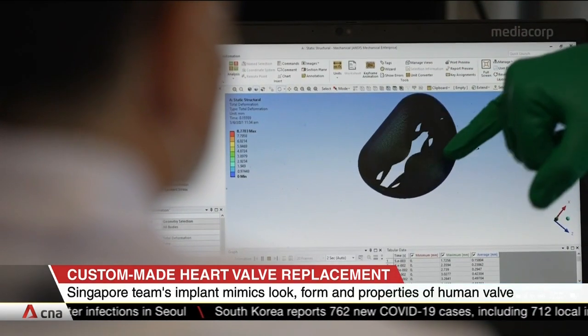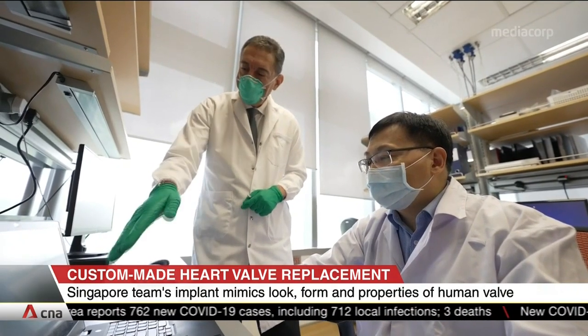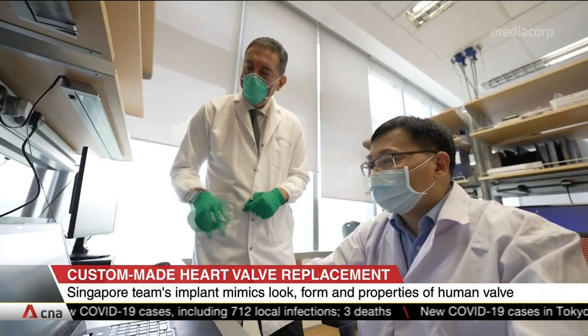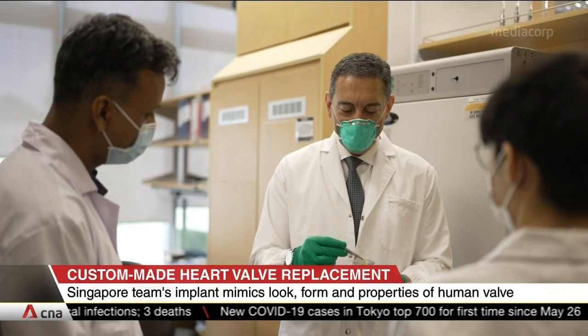The National University Health System team has been awarded almost $5 million by the National Research Foundation Singapore to further test and develop SingValve. It's said to be trialed in humans in two years.